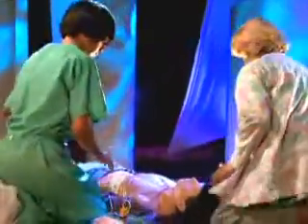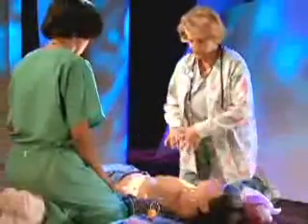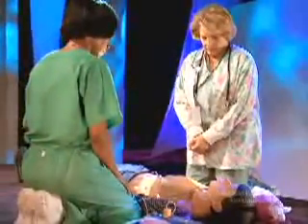Begin CPR. After 5 cycles of 30 compressions and 2 ventilations, pause for the AED to analyze. Analyzing heart rhythm. If indicated, press the shock button and switch rescuer roles. No shock advised.